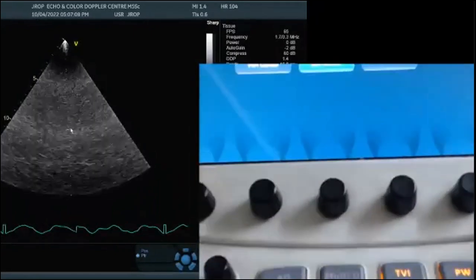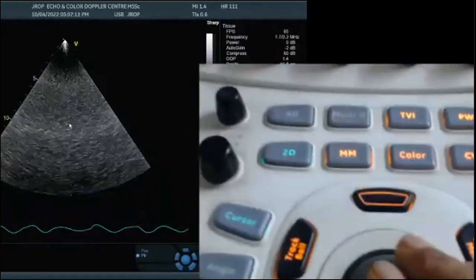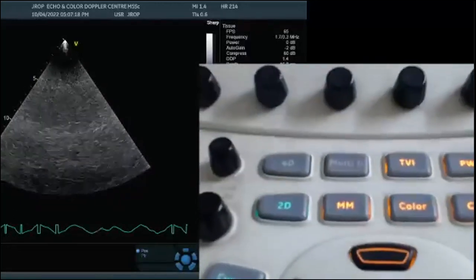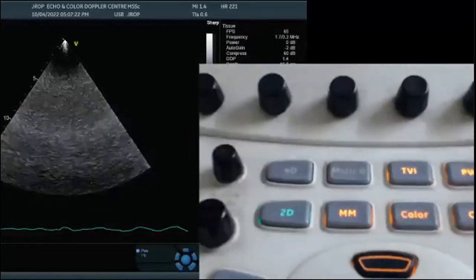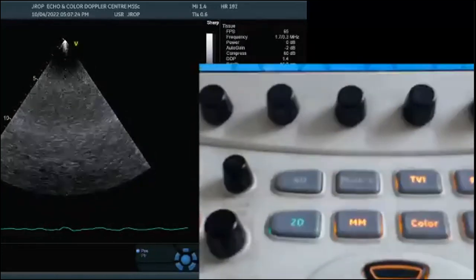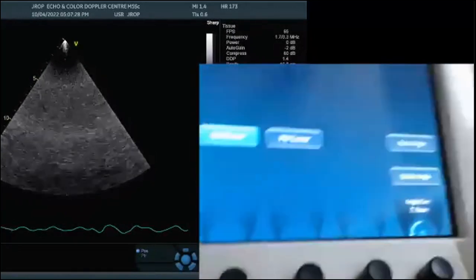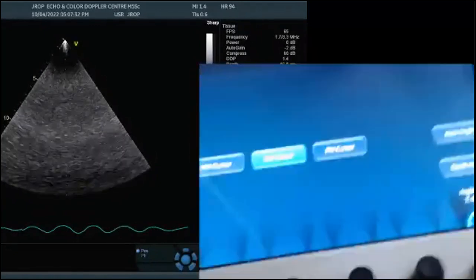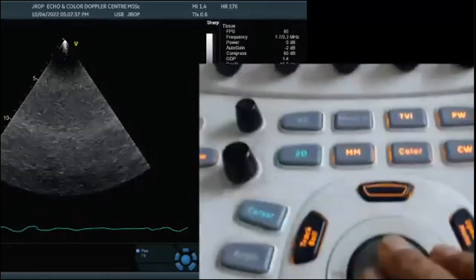This is the site of a sample volume which we move in this machine by trackball. I can move this sample volume anywhere I feel like on the screen. Right? Can you see this sample volume is moving on the screen? So it helps you in doing a patient's site evaluation. That's what exactly we mean today: we take the sample volume to a site evaluation.